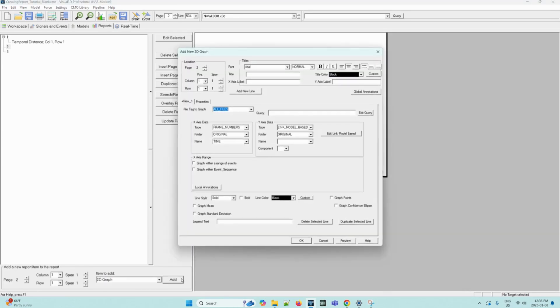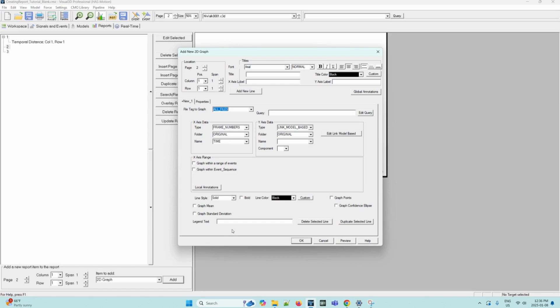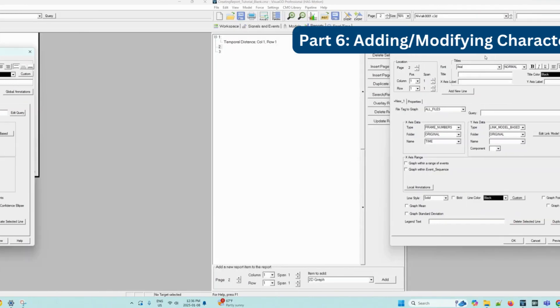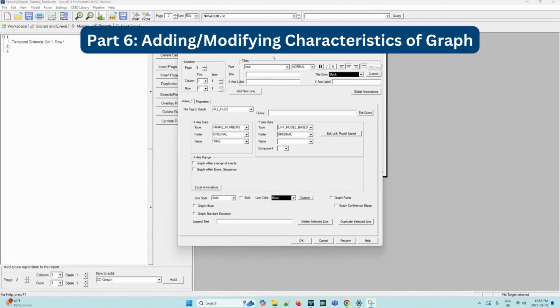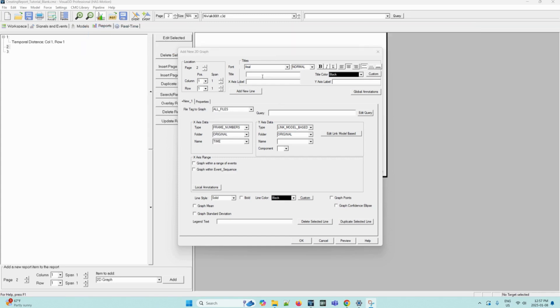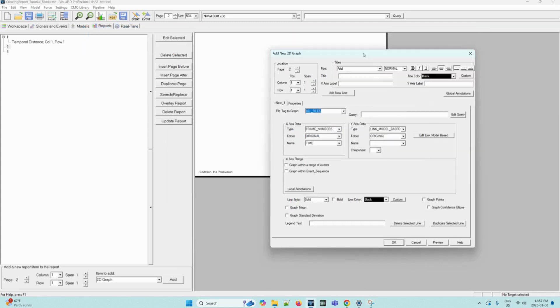This will prompt the dialog box open. This section will create a 2D graph of sagittal knee kinematics being graphed as a percent of the gait cycle from left heel strike to left heel strike. The dialog window is separated into four sections as you can see. So it's the graph title and graph properties, x-axis properties and y-axis properties. We can now begin to fill in information in this dialog box in order to display the 2D graph on our second page. So we will be entering the information shown in the following image.